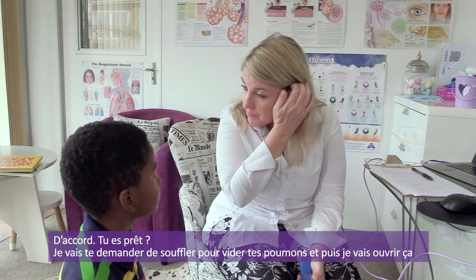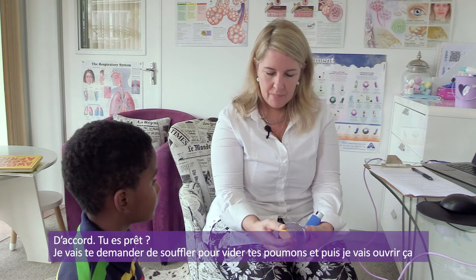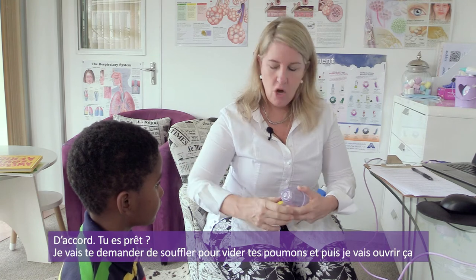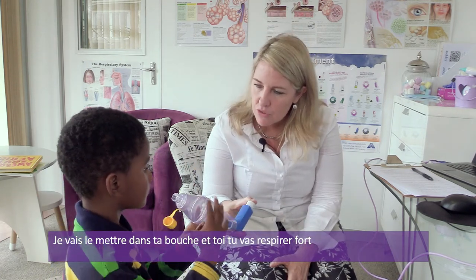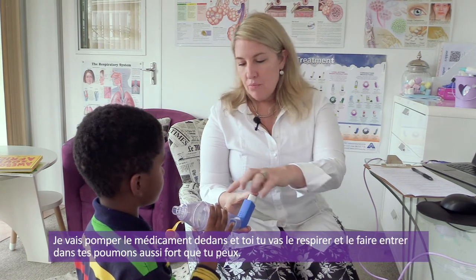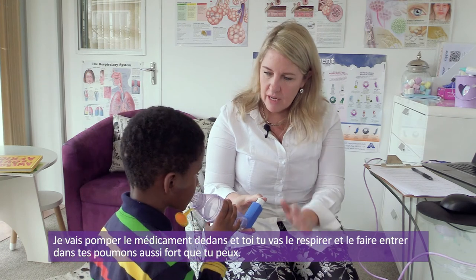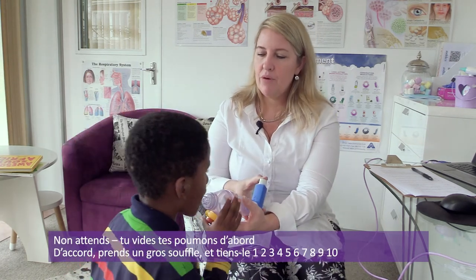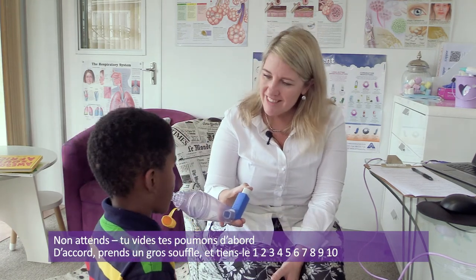Okay. Are you ready? So what I'm going to ask you to do is to breathe out. And then I'm going to open this. Okay, I'm going to put it into your mouth. So I'm going to spray the muti into there and then you're going to suck it from there down into your lungs as hard as you can. Hold on, my boy. Okay, wait. Okay, are you ready? Okay, breathe out. No, wait, breathe out first. Good. Okay, put it in your mouth.